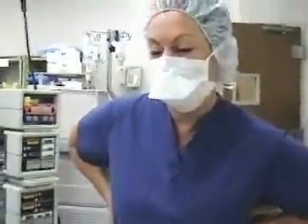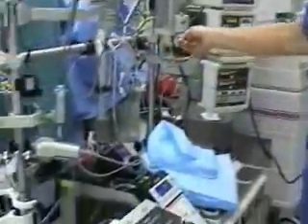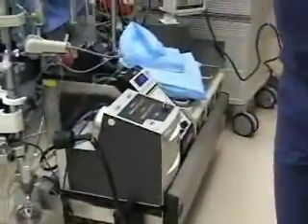Hi, I'm Beth, and I'm the perfusionist, and I'm also an RN. This is the heart-lung machine, and it takes the place of the heart and lungs while the surgeon operates.